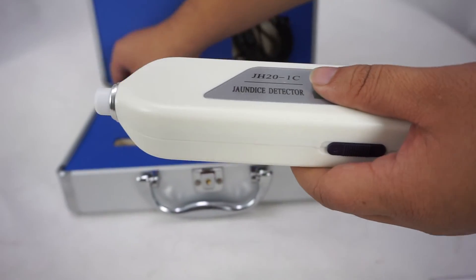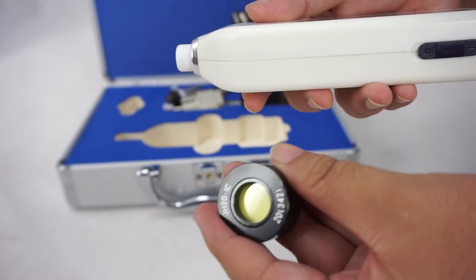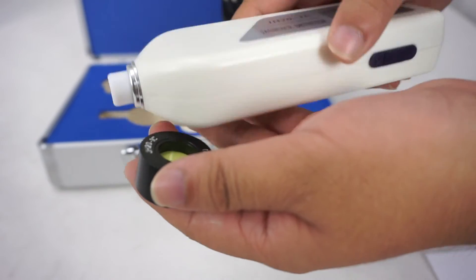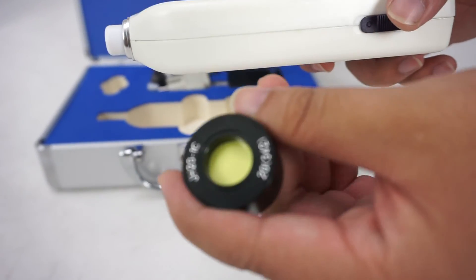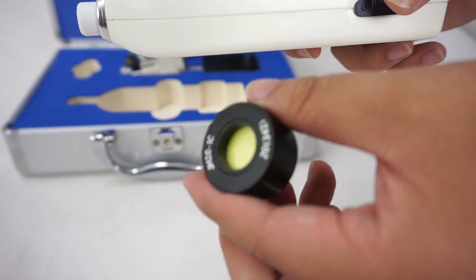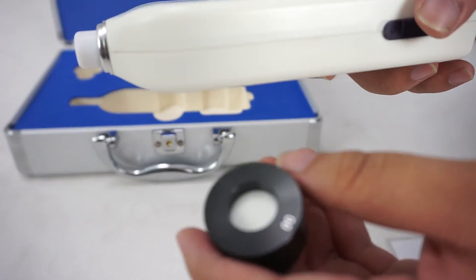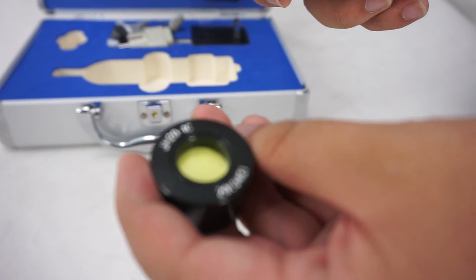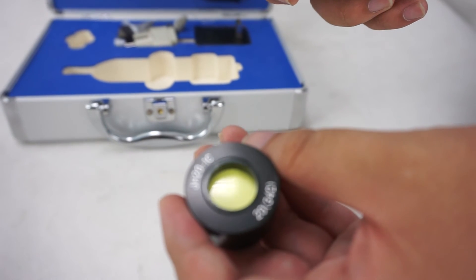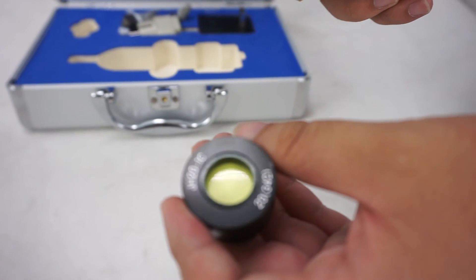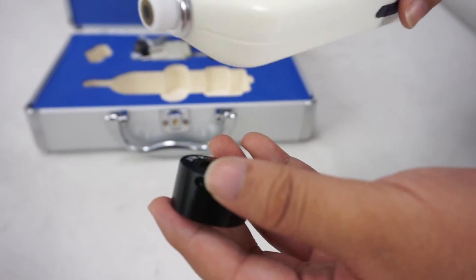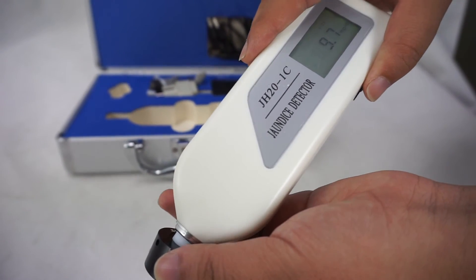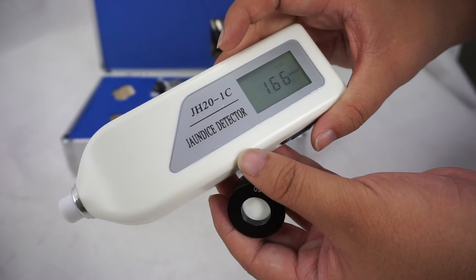We use the checker plate. The checker has two sides. One is yellow and another is white. The instrument should be inspected before detecting. We will see the parameters on the display.